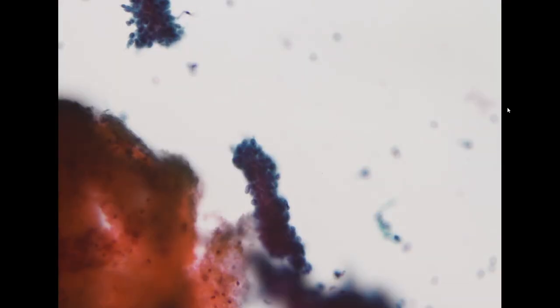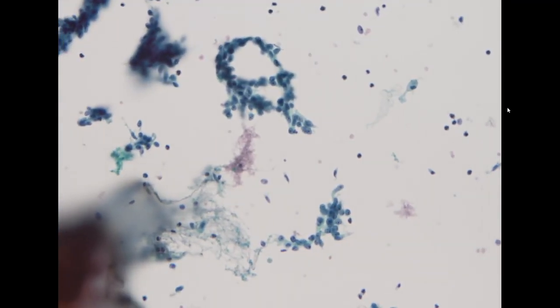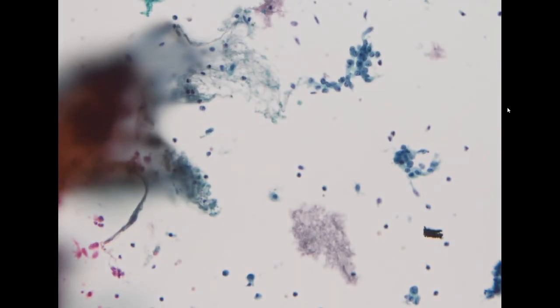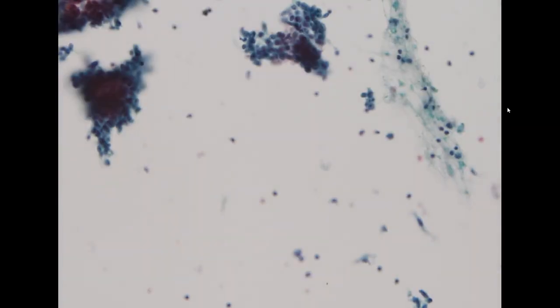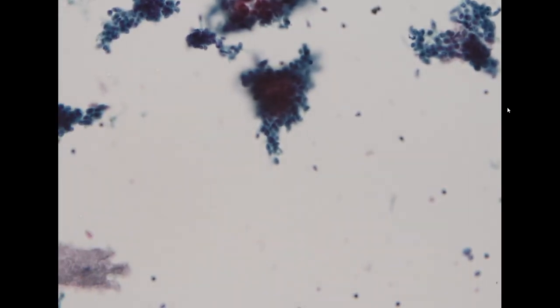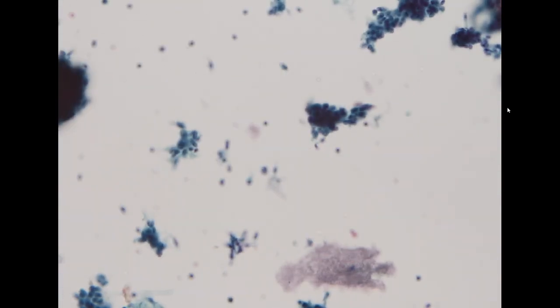So this looks like a carcinoma, but with a little bit of spindling, we would usually think about, could it be of myoepithelial cell origin, or could it be of ductal epithelial origin with this spindle morphology?